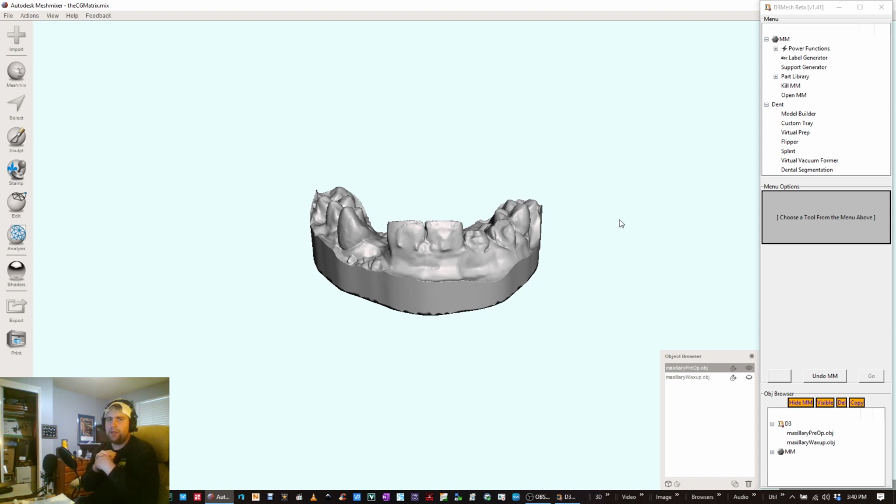And he used a flowable composite, a bioactive flowable composite called Activa. Not sure how it's pronounced. I know one's yogurt as well, so I don't want to say the wrong one. But it's one of those. I think it's Activa. It's a flowable, one of those new types of bioactive composites, and dual cure as well. So even if you don't get a full light cure on it, it should cure on its own.